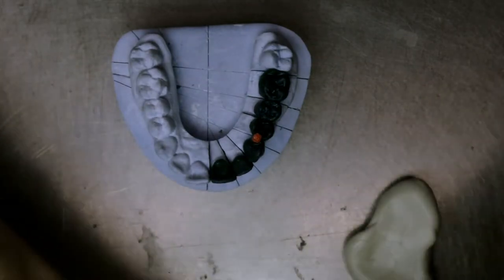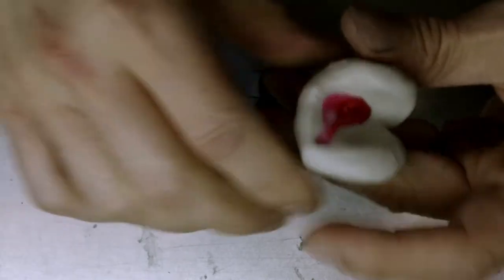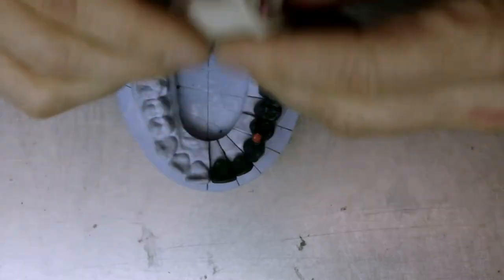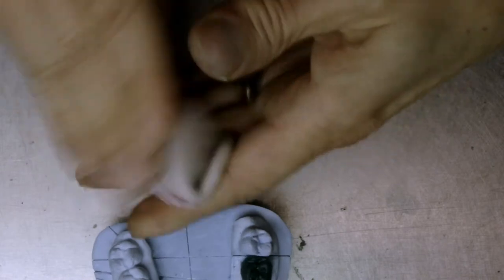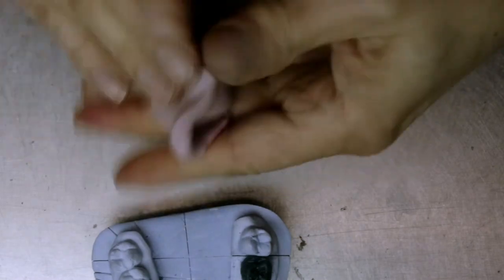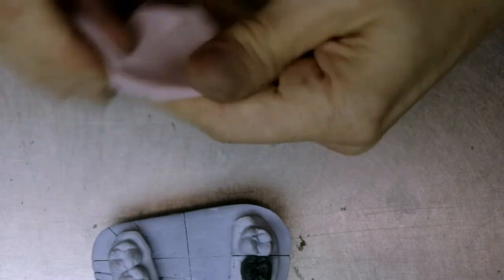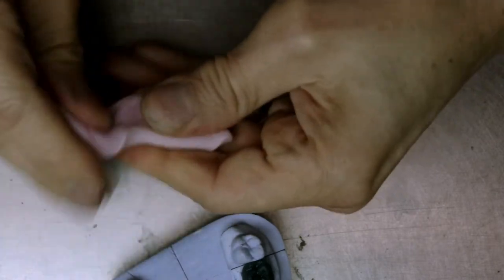So what we need to do is mix the putty with the accelerator until there are no lines on it. It should have a nice, deep pink color. If we don't put enough accelerator in it, it will set very slowly, so it's important to put enough, especially if we're in a hurry. It's not going to affect the properties, it's just going to affect the setting.